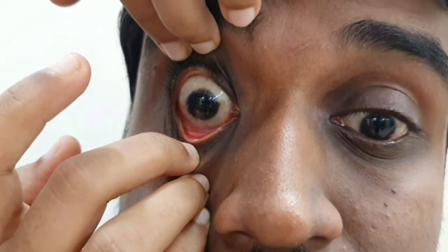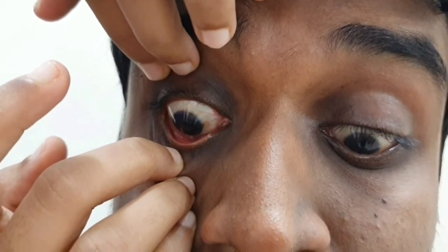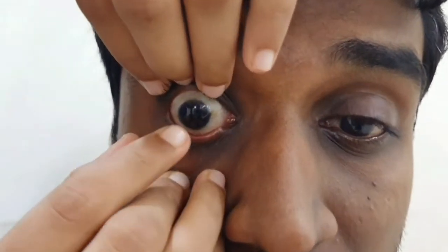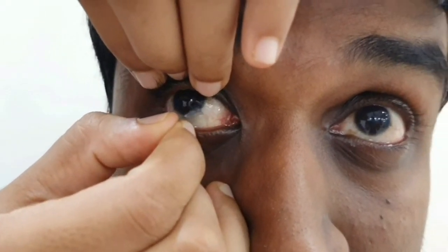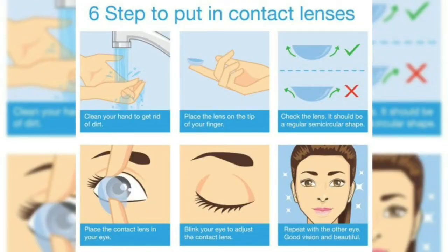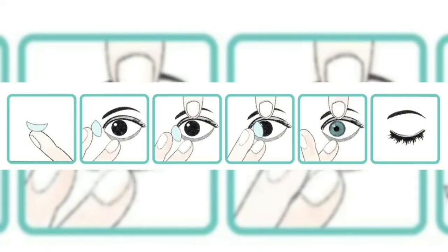Look down slowly, then pinch out the lens — that's it. Repeat the same procedure for the other eye. Thank you, have a happy day!